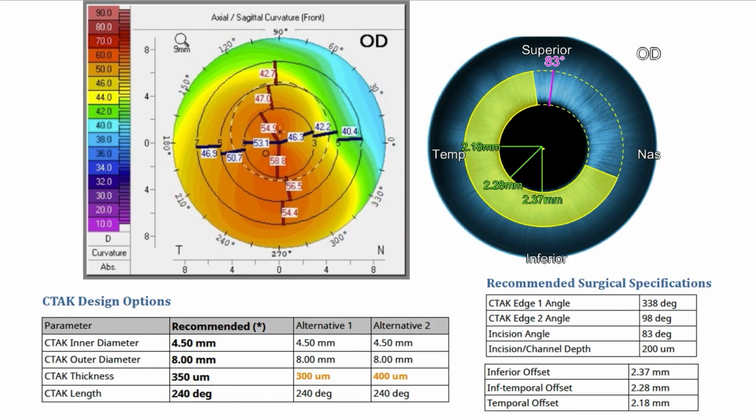And this is a nice starting configuration in terms of choosing some of your early cases. Moderate keratoconus are nice patients to start with, right? They have a lot to gain because they're not mild, right? But the advanced patients are a little bit trickier. Some of them may remain RGP dependent for their best vision or may need secondary procedures. So pick your first patients moderate, I would say.